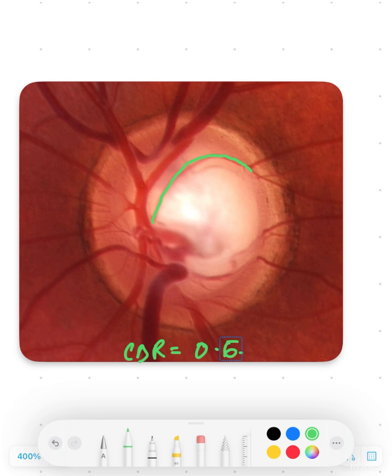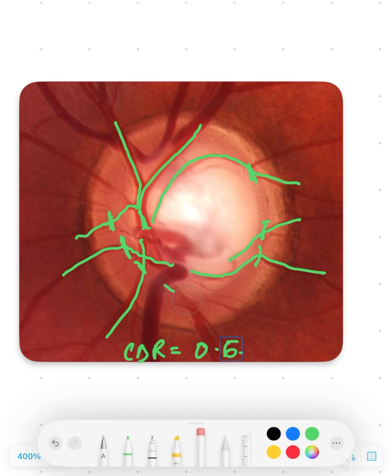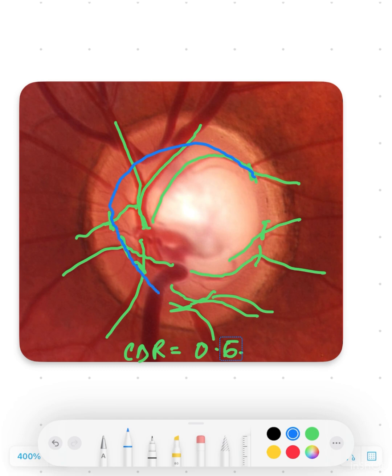We have a vessel arising here bending outwards somewhere here, another vessel not really bending anywhere, another vessel going out straight, a vessel bending at this point, a vessel going along the slope of the cup and bending right here, this vessel bent right here, and a few vessels bent like this major vessel here. When we join all these bends, it actually comes up to a CDR of 0.85.